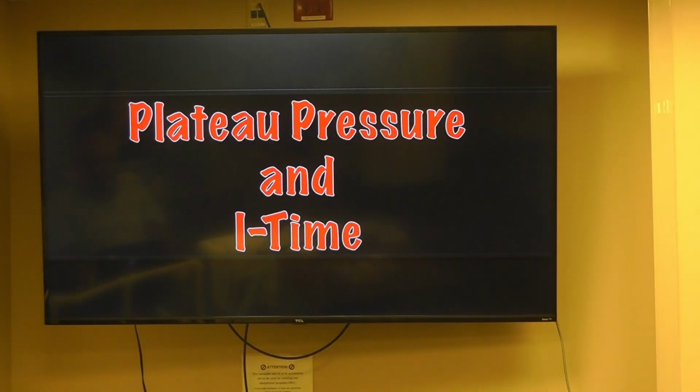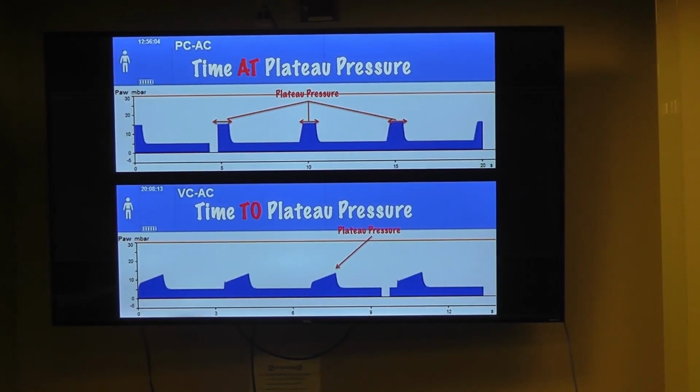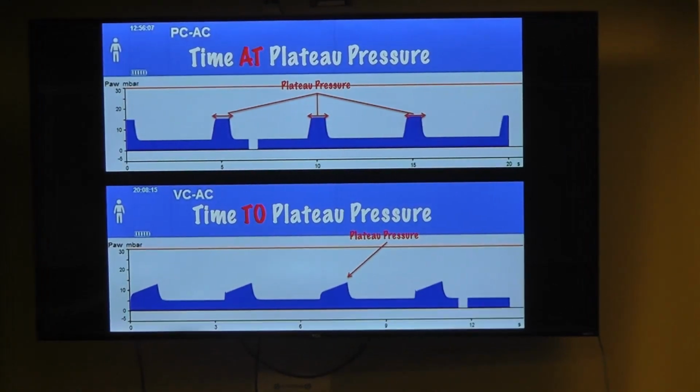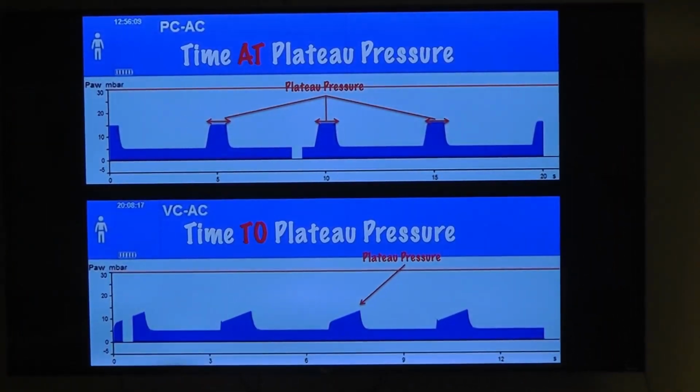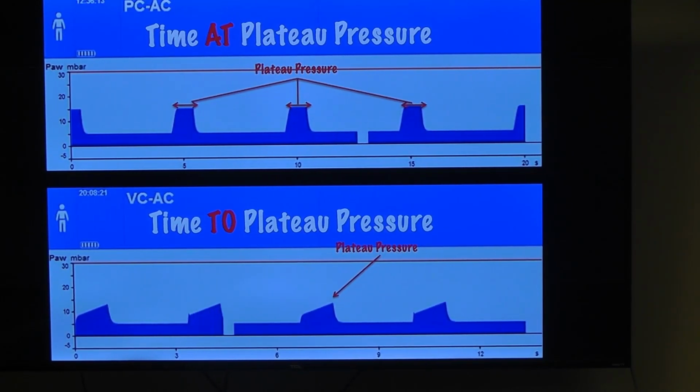Plateau pressure and I-time. This is another way that I want you to think about plateau pressure and I-time, but particularly plateau pressure in relation to I-time. So in pressure control ventilation, I-time equals time at plateau pressure. Okay, and in volume ventilation, I-time equals time to plateau pressure.